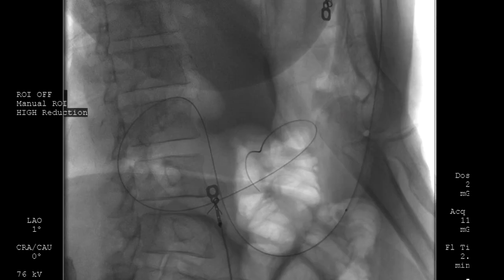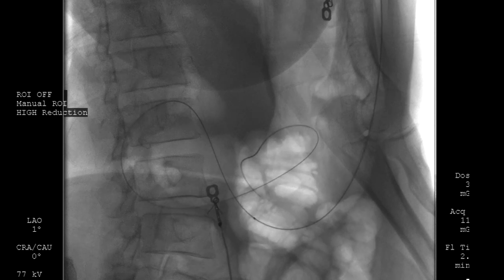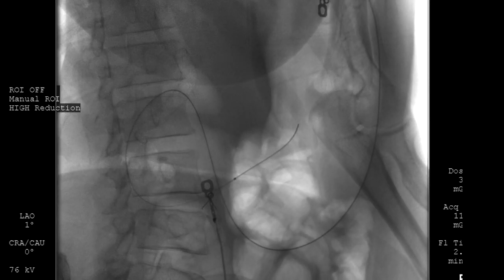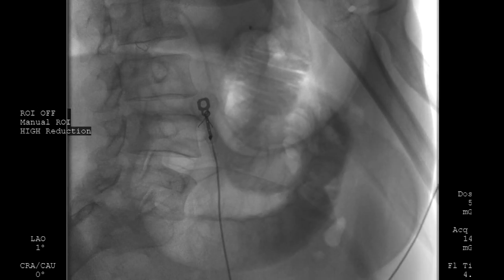Once the stricture was traversed, an angled guide wire was passed through the channel of the endoscope and into the jejunum. The endoscope was then removed over the guide wire, and a tandem catheter was inserted over the guide wire and passed into the jejunum. The guide wire was then removed, leaving the catheter in place.